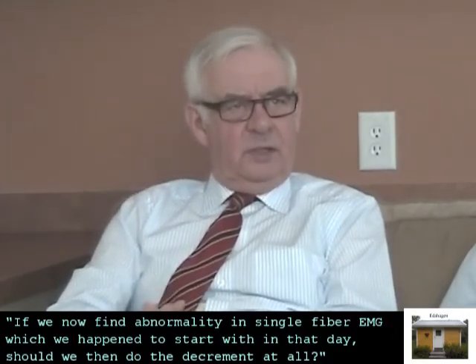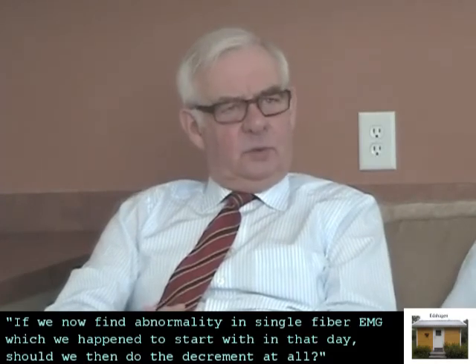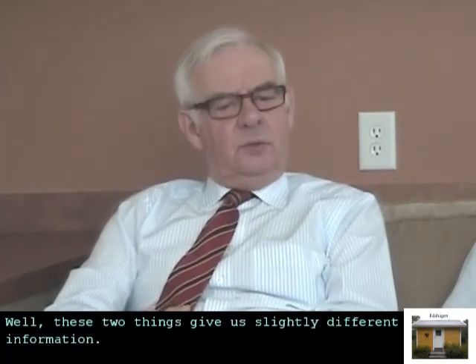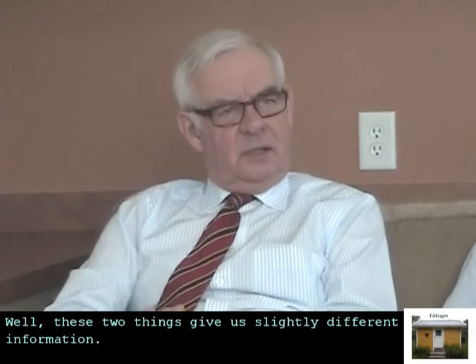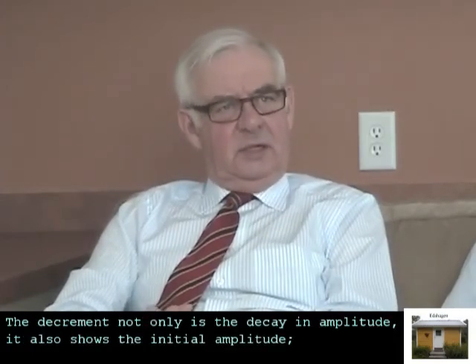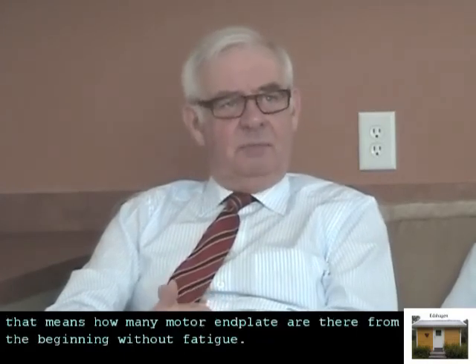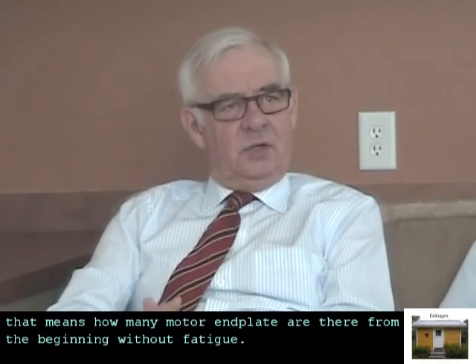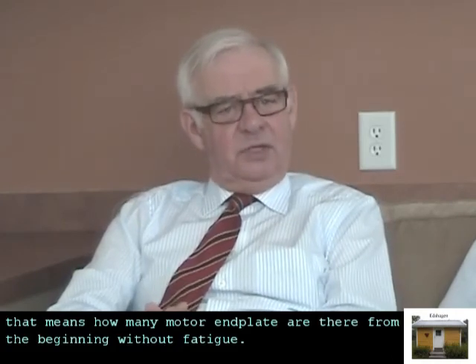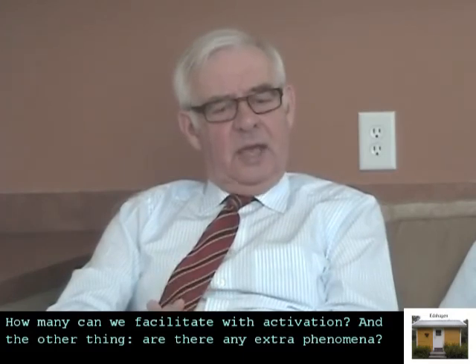And regarding the decrement, one can say if we now find abnormality in single fiber EMG, which we happen to start with that day, should we then do the decrement at all? Well, these two things give us slightly different information. The decrement not only is the decay in amplitude, it also shows the initial amplitude. That means how many motor end plates are there from the beginning without fatigue. How many can we facilitate with the activation?